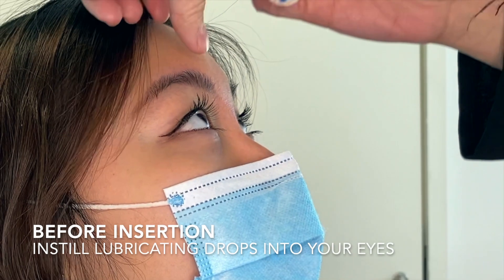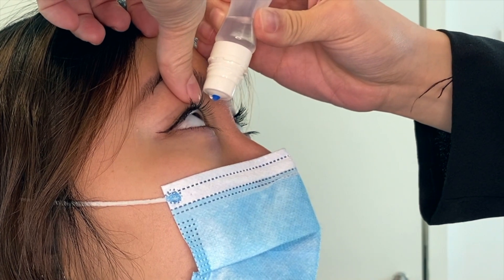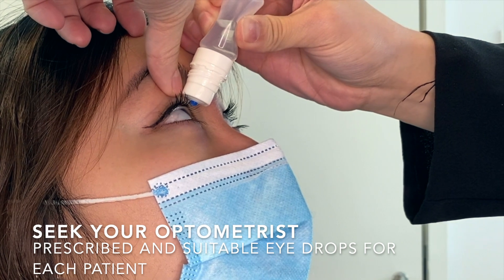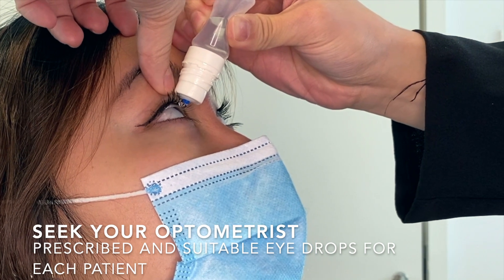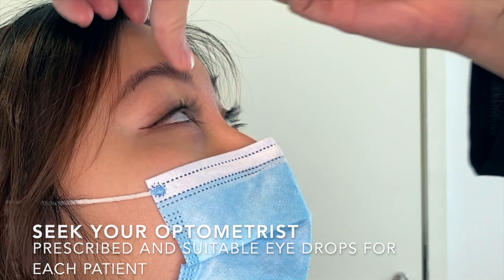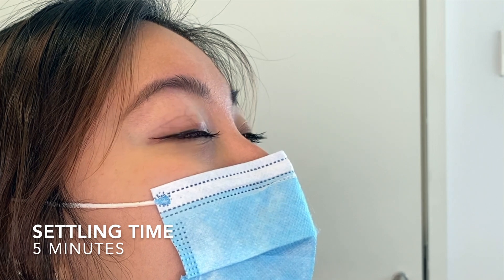We will instill a drop of artificial tears into the eye before wearing the lenses. Depending on the type of lens and your eye condition, the eye drops that are prescribed are different. So do seek your optometrist's advice on the type of eye drop to use. Remember to leave the eye drops in your eye for 5 minutes.